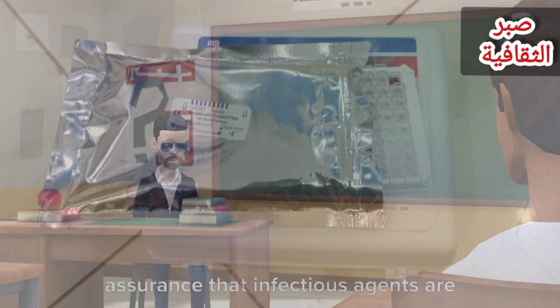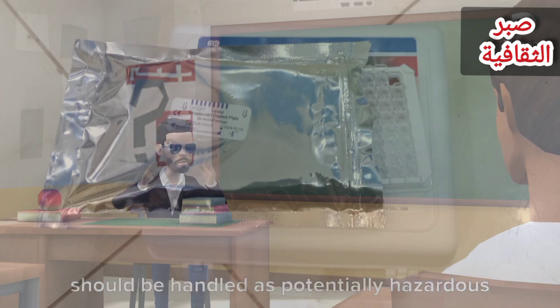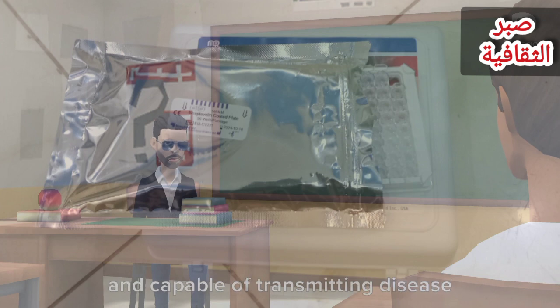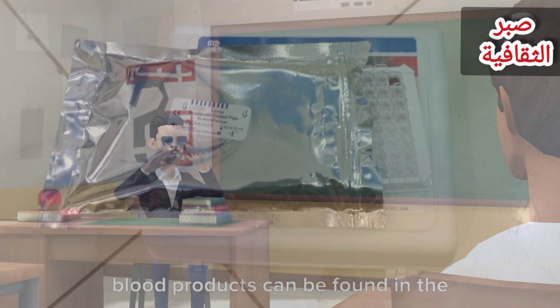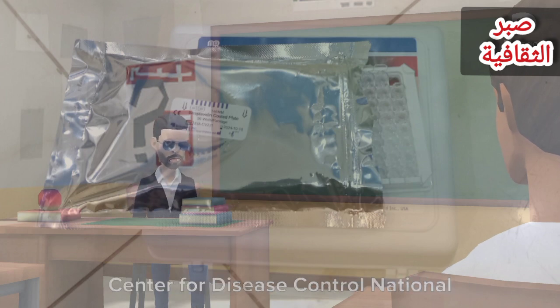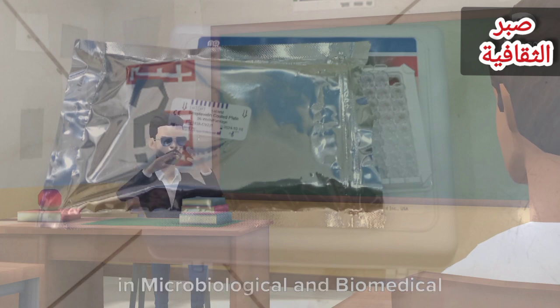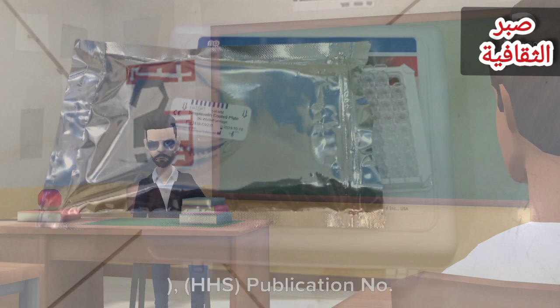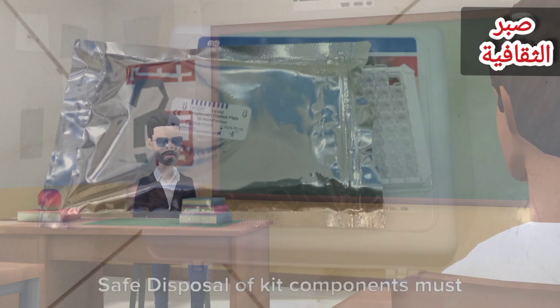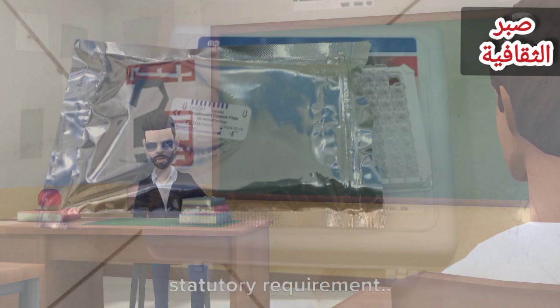Since no known test can offer complete assurance that infectious agents are absent, all human serum products should be handled as potentially hazardous and capable of transmitting disease. Good laboratory procedures for handling blood products can be found in the Center for Disease Control, National Institute of Health, Biosafety in Microbiological and Biomedical Laboratories, 2nd edition, 1988, HHS publication No. CDC 88-8395. Safe disposal of kit components must be according to local regulatory and statutory requirements.